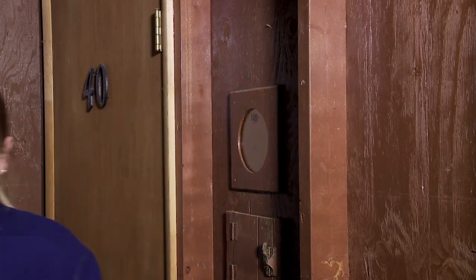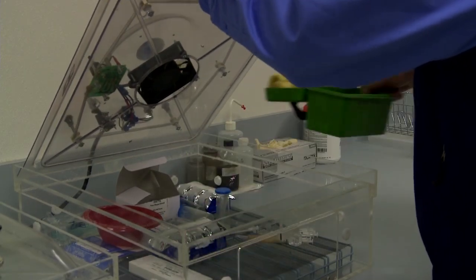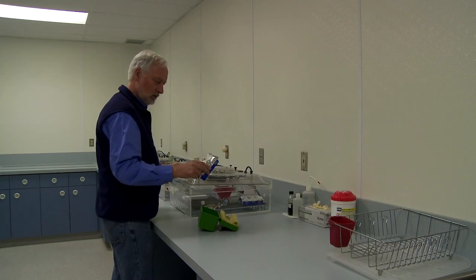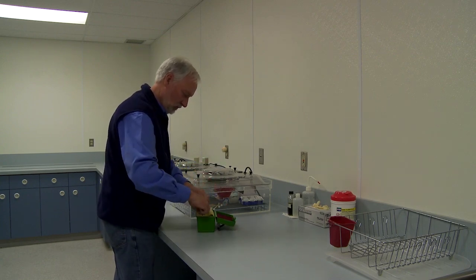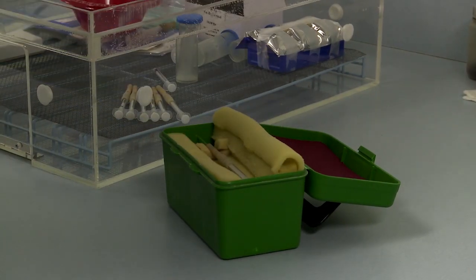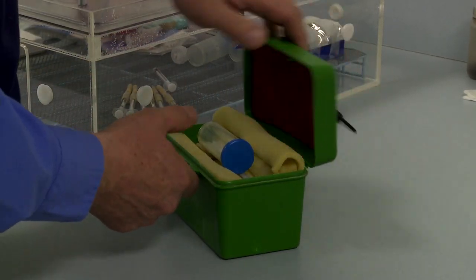After Heather discovers an egg, Cal gathers the tools that will be needed for the artificial insemination. These tools are warmed in a 99-degree Fahrenheit incubator so they will not cold shock the semen during collection. A warm gel pack is placed in a small carrying container and a foam pad is laid on top. This protects and warms the microhematocrit capillary tubes for semen collection and the artificial insemination tools.